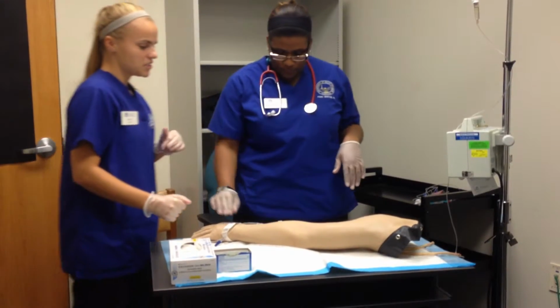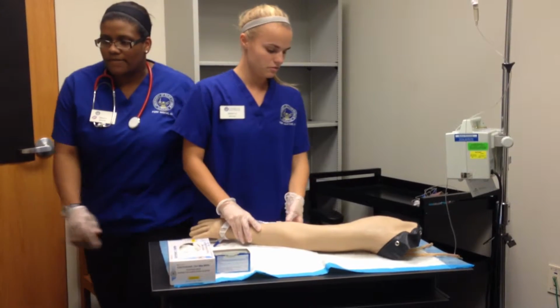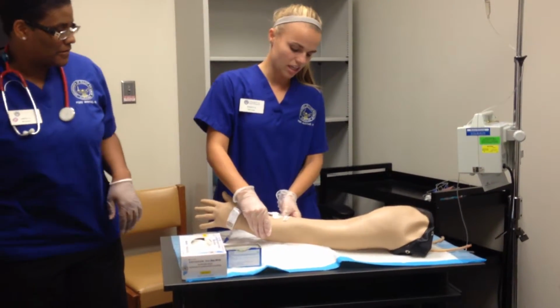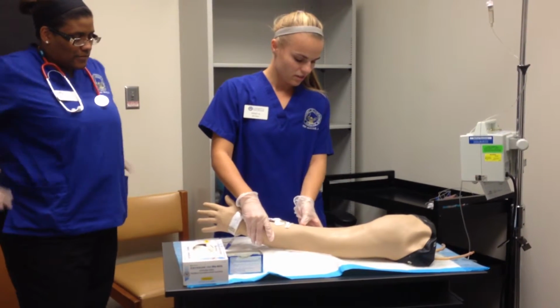Okay. We're going to use your IV site for the infusion. We're just going to check to make sure that it's all intact and in a good vein, which it looks like it is. Alright.